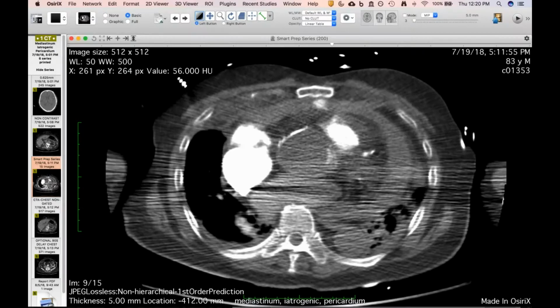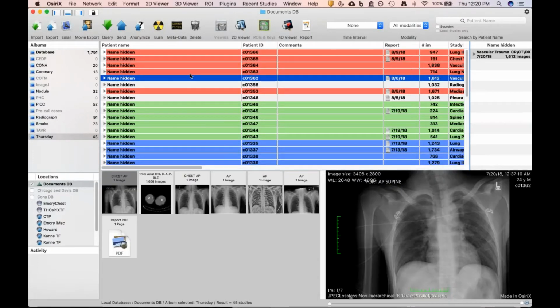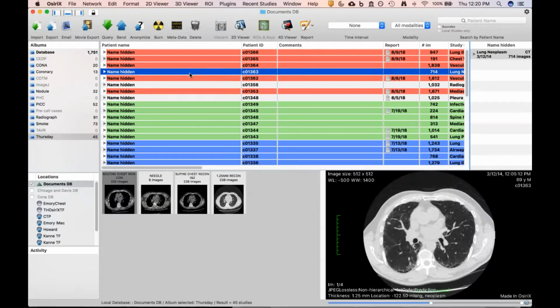So, very impressive. My goodness. Yeah, so at least that's my theory, that he probably had an infarct, which led to the resuscitation. And the timeline of his troponins being elevated and such fits with that as well. Let's see, what do I want to show next?